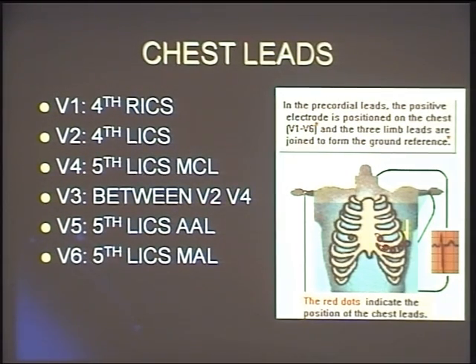V3 is placed between V2 and V4. V3 does not have a specific place. It is placed between V2 and V4.